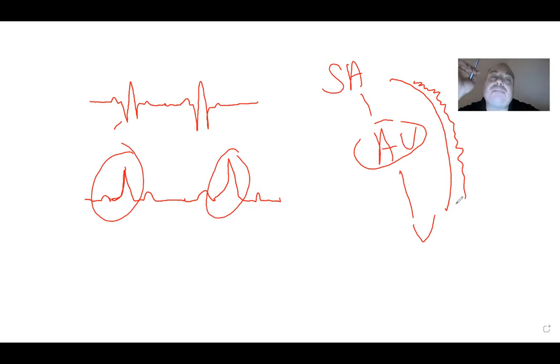What I will tell you is that people don't go in and out of WPW. They live in it. It's always going to be there on their EKG. So that doesn't mean it's always going to have a problem, okay? In fact, rarely will it have a problem. You might meet some people that are 25, 30 years old. You do an EKG and it's a completely incidental finding and they've never had a problem from it. It doesn't mean they won't. In fact, they're more prone than a regular person to, but it's not always problematic, but it definitely can be.